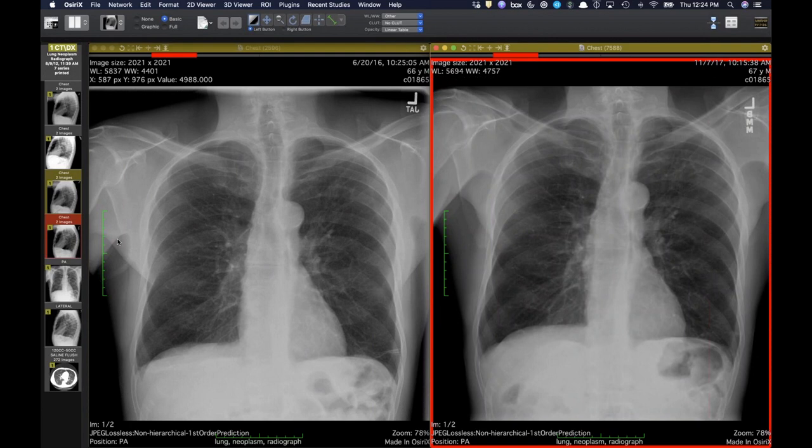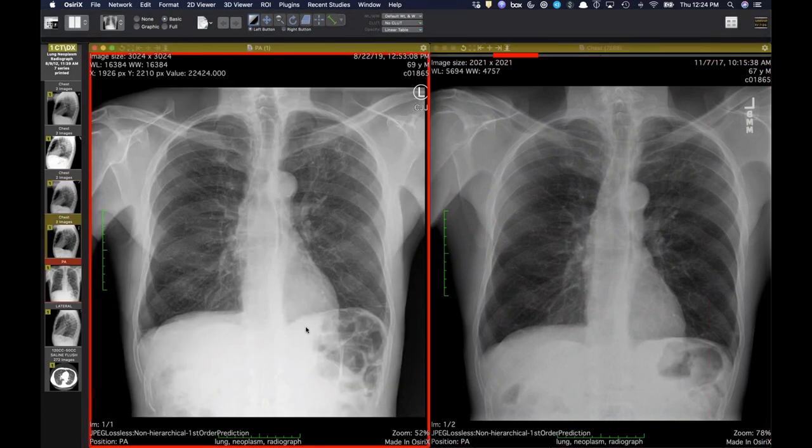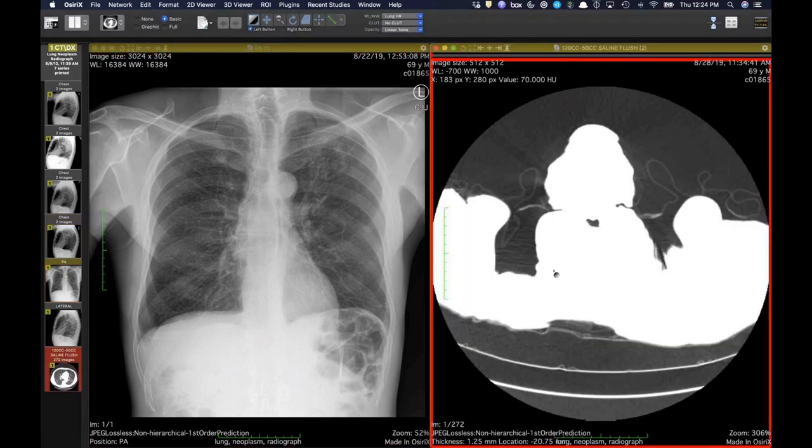Yeah, because once you actually see it, now we'll go to the next one here. So this is now by 2019. So this thing's actually present for 5 or 6 years. Is there a cavity in the left apex? Good. Yeah, this thing right here. And now you can, in retrospect, maybe see it here. So this is one that I think is when we finally spotted this. Yeah, so it was this one in 2019. And so that went on to CT.